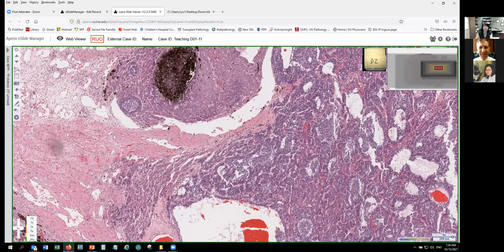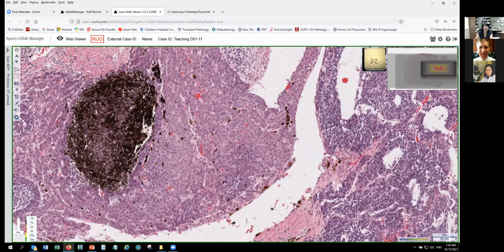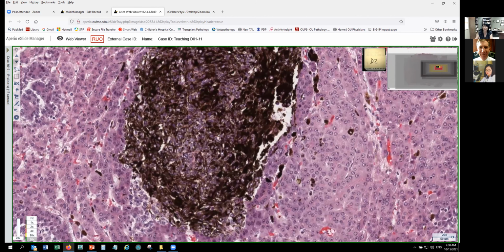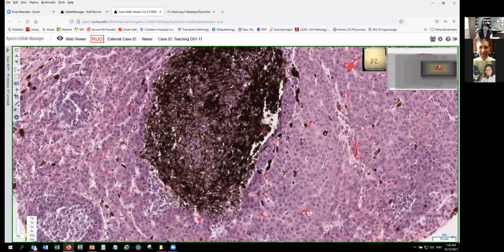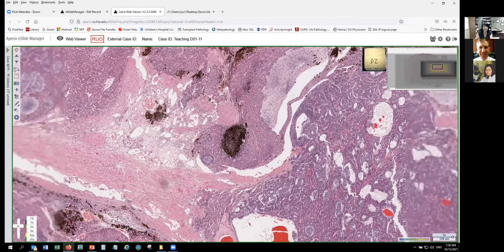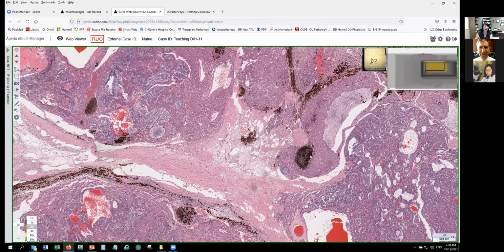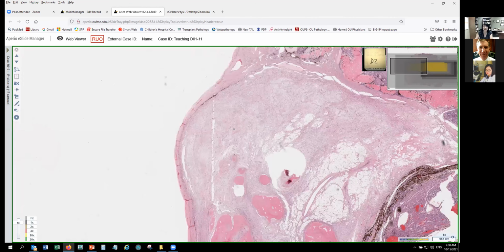They are more those kind of melanin pigment. And probably there's what we call the teratoid feature, which is like a retinal kind of melanin pigment. So that's that area, and I will come back to this area. Then you go to this paler area.